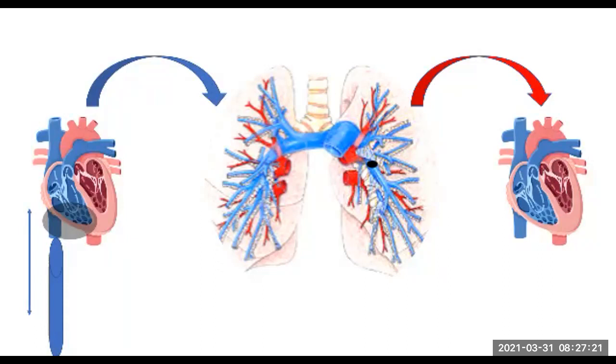And let's go one further back. What do you think is going to start happening to this IVC? It doesn't happen so much to the SVC because of gravity, but what happens to the IVC? Yeah, very good. So there's going to be pressure build-up over there. All right. So as the pressure builds up, you're going to start to get an IVC that starts to get larger. Agreed. Its diameter is going to increase.